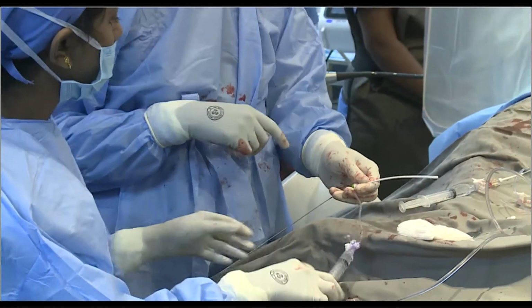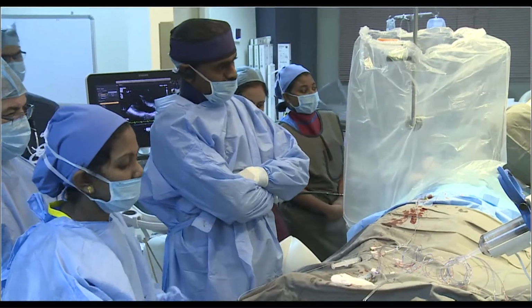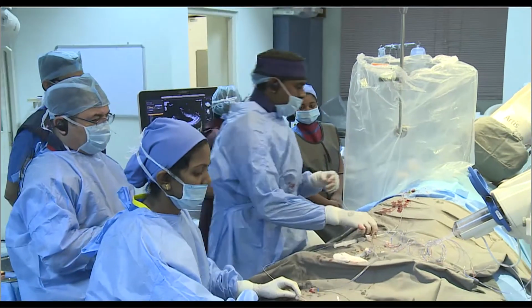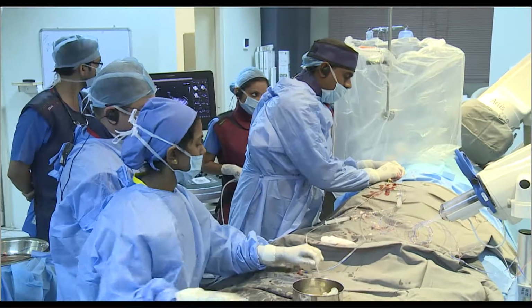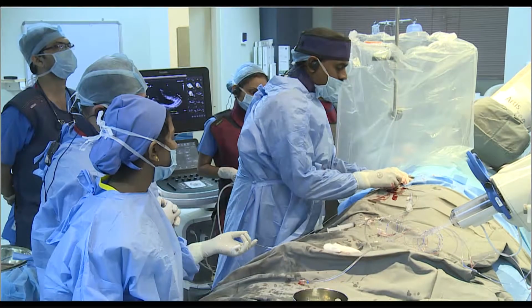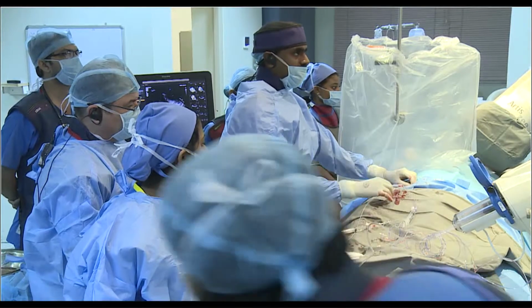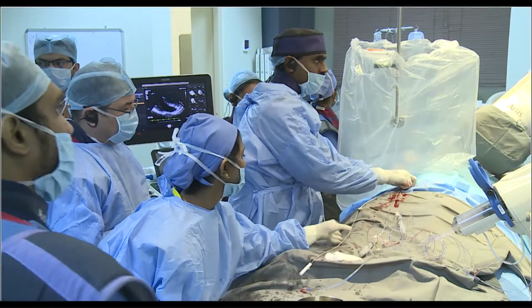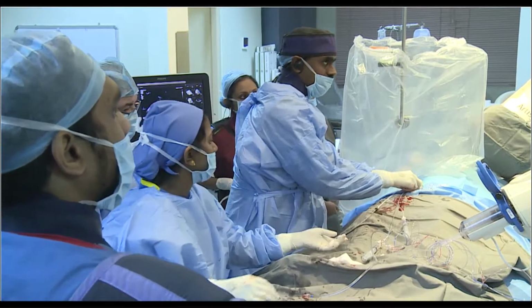What Damien and whoever has used a multifunction occluder, what is your view? Yeah, one of the advantages, since it is a non-self-centering device, it doesn't hurt the AV node much, so the chances of AV nodal injury are much more remote in this particular product.